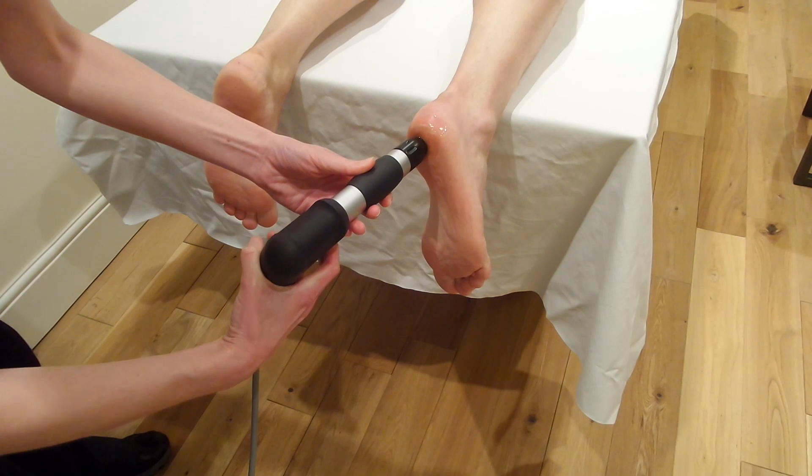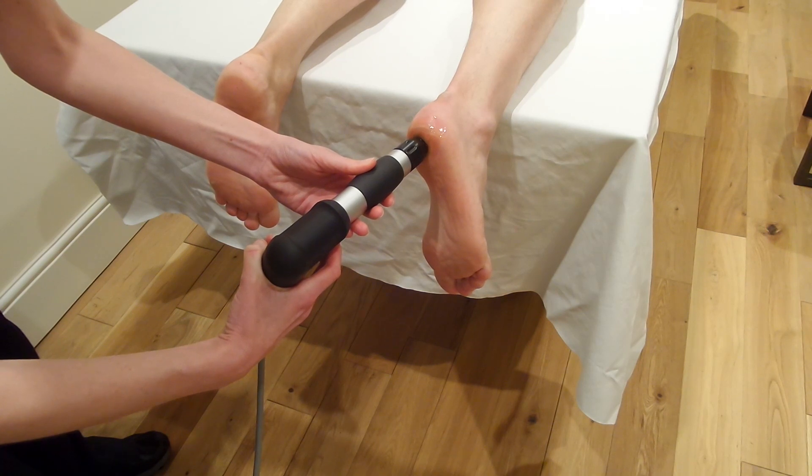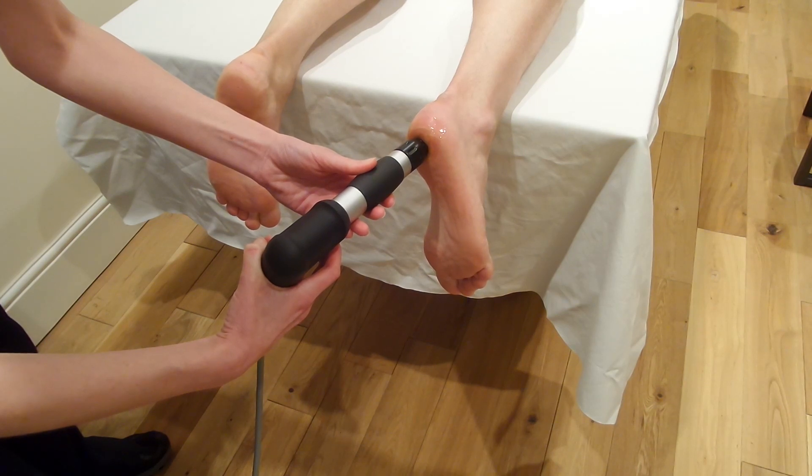Now we're going to come onto the proximal attachment of the plantar fascia and apply the shocks. This is a very direct treatment. You can angle the treatment head during the treatment to try and get a better angle, slightly up and down, just as the plantar fascia attaches onto the calcaneus.